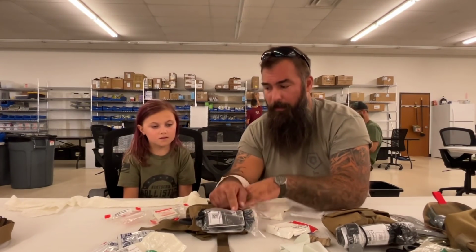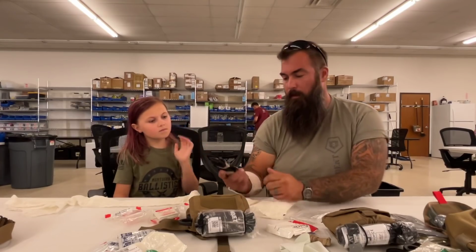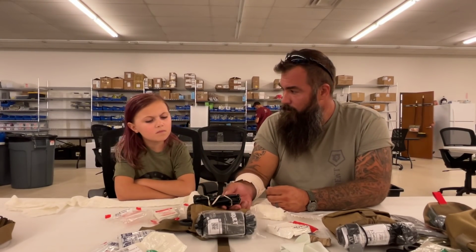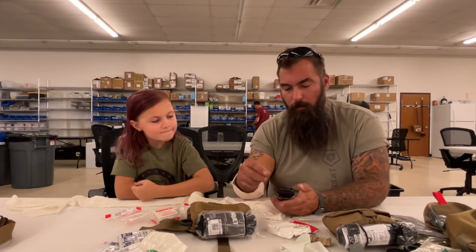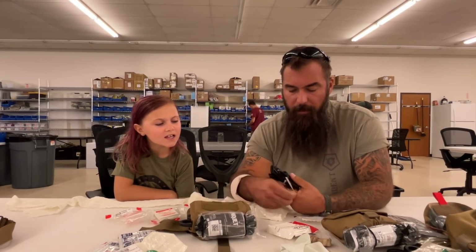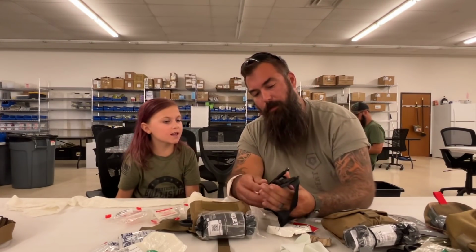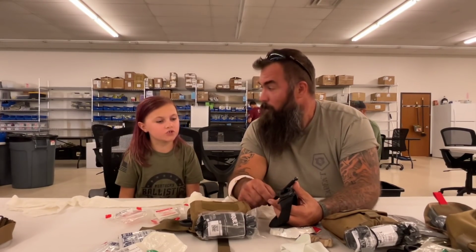Yeah. And that's the same one. I carry one every day in my back pocket. This is it right here. You ever seen one of these? I think Twitch showed us one of those. Yeah, I think so. Yep. And so this is different than a cat tourniquet, but this is the soft T. It works the same way as the cat does. It's called a windlass tourniquet. So this stick right here is the windlass. Okay, yeah. Twitch did show us one of those.